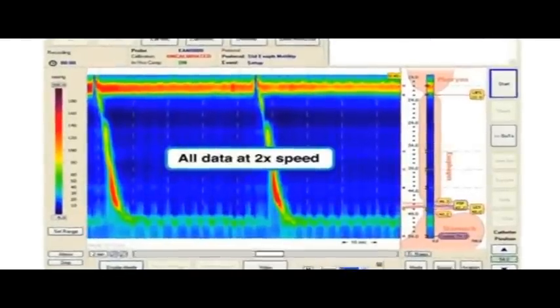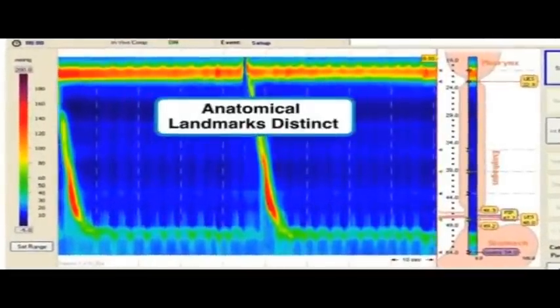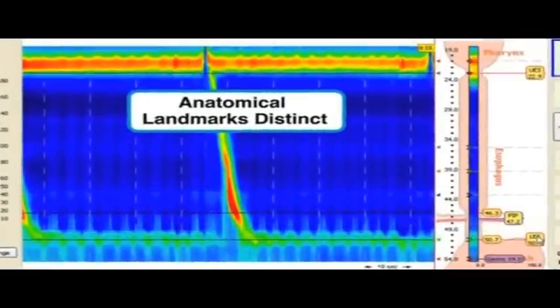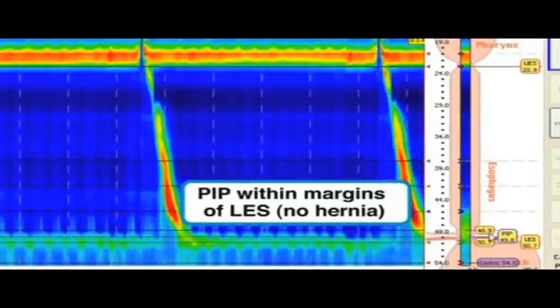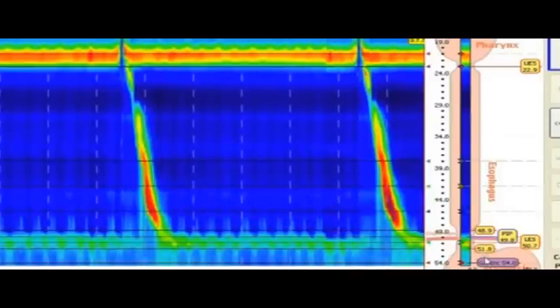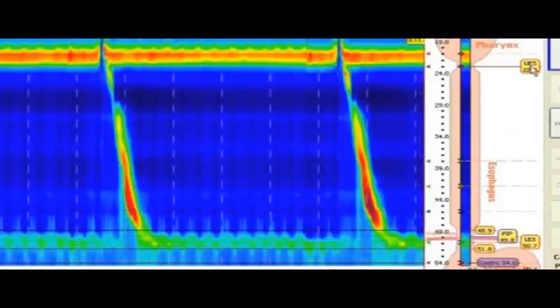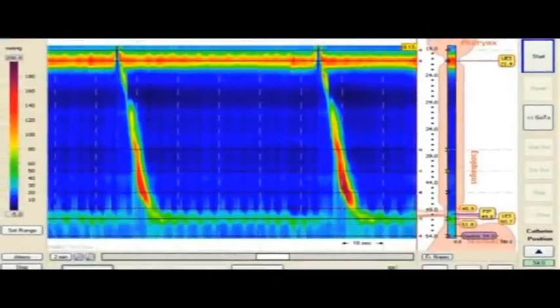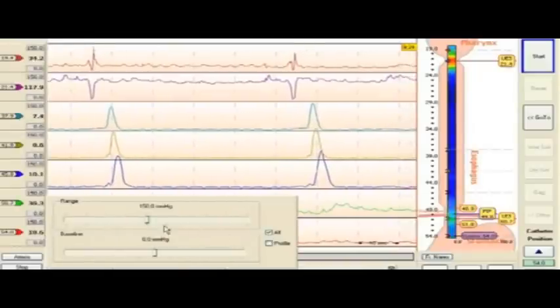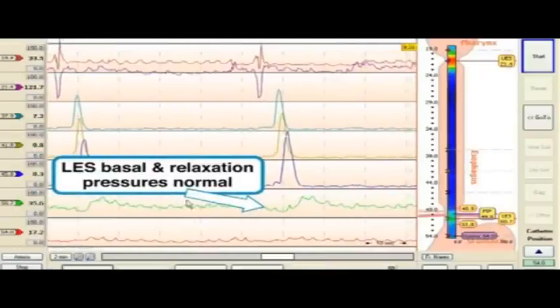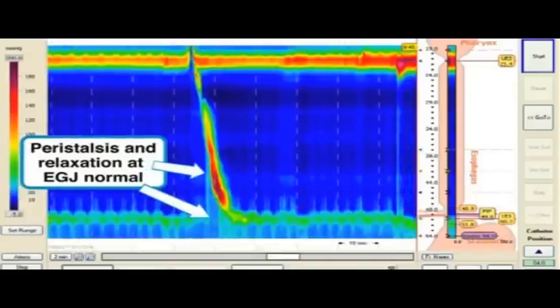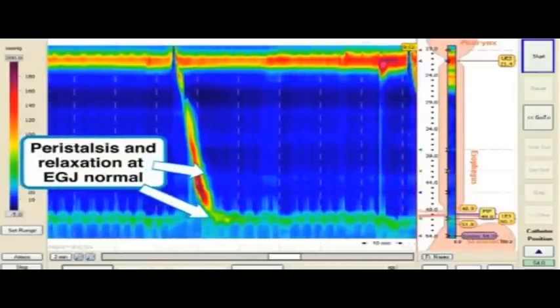Normal esophageal motility. In this subject, anatomical landmarks are distinct, and the pressure inversion point is within the margins of the LES, indicating no hiatal hernia. LES basal and relaxation pressures are normal. Peristaltic velocity and relaxation at the EG junction are normal.